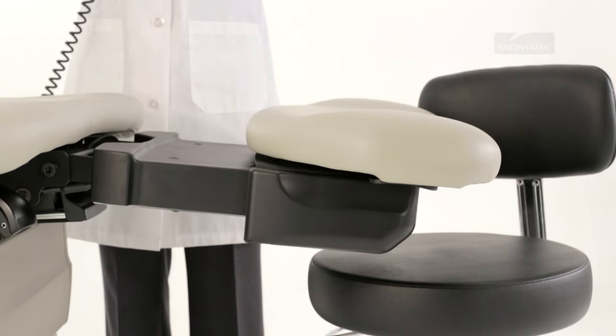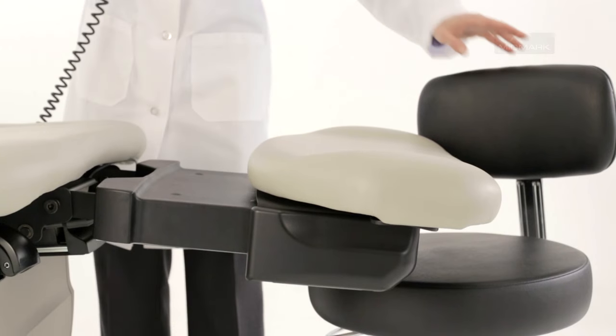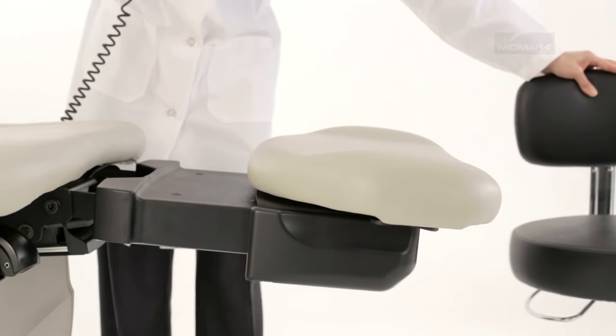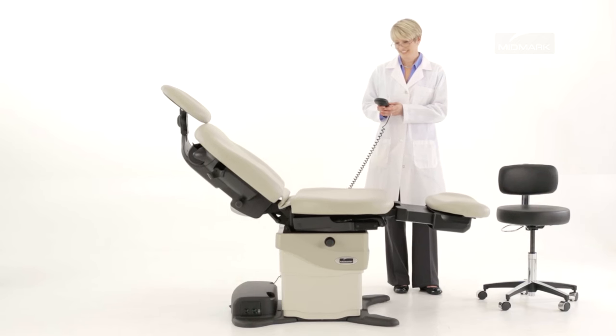You will hear a single beep when the system is activated. To resume the base down operation, remove any objects from under the foot section, check if the foot extension is extended, then press the base down button.